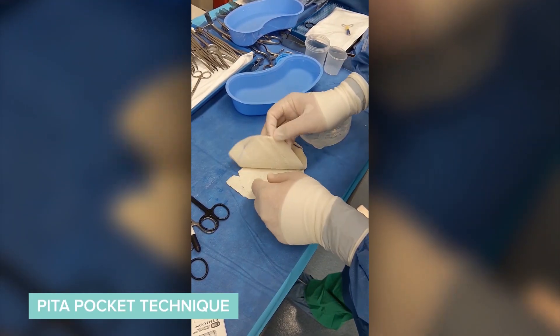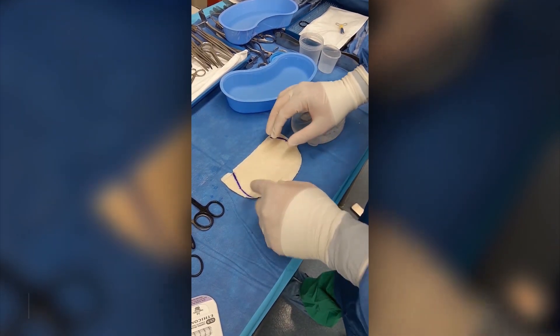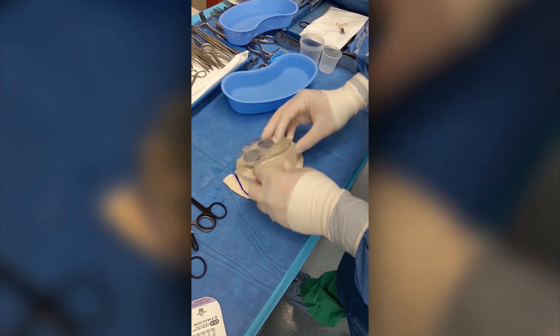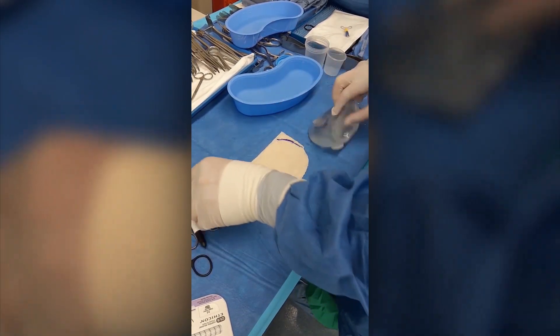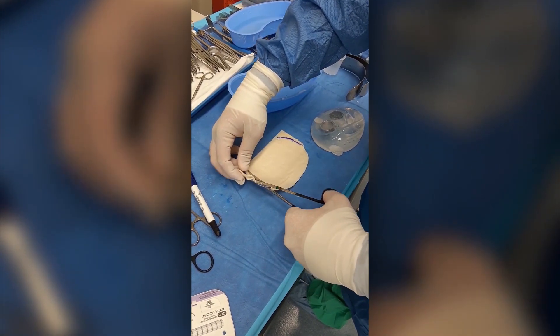We've got our biologic shaped mesh material here. We've got one piece. I've got the deep surfaces facing each other. I'm going to sew them like this, but before I sew them, I'm going to just contour this pita pocket. I put the expander on here and I mark out the edges and I actually cut these off on both ends so that it's going to be shaped.